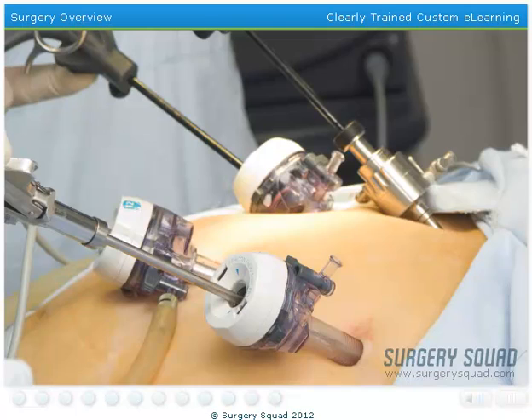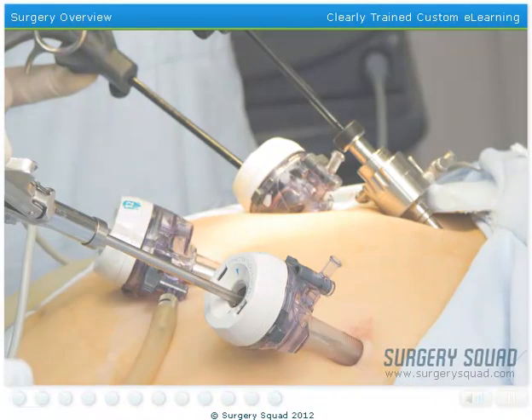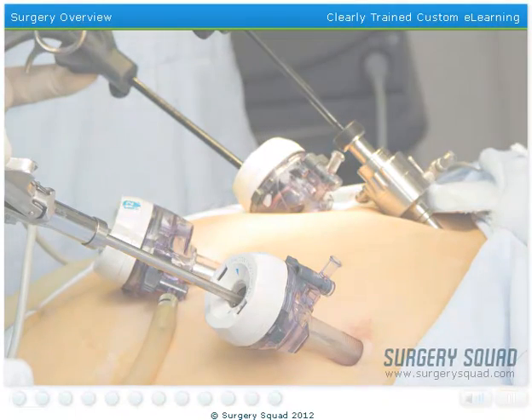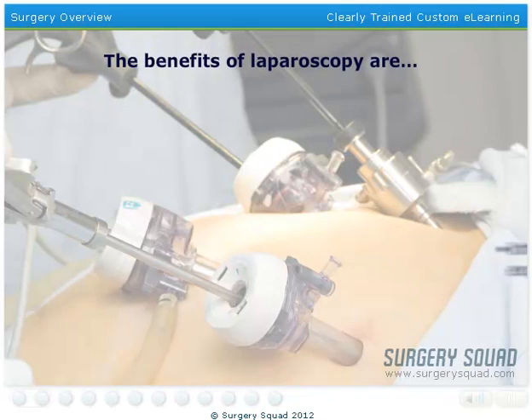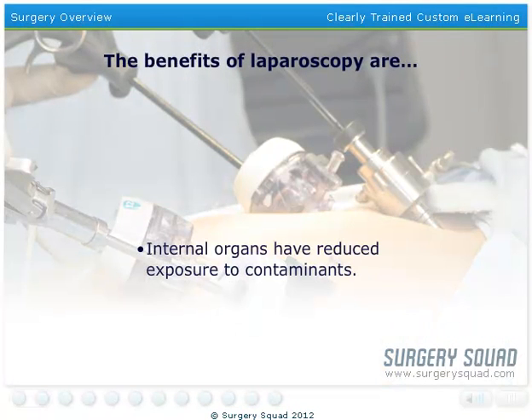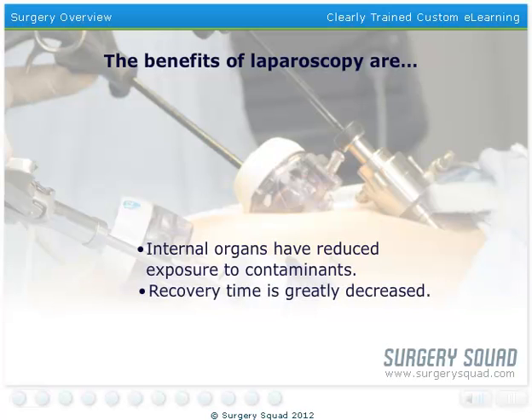Today, we'll be using a minimally invasive technique called laparoscopy to remove our patient's appendix. Laparoscopy reduces the exposure of internal organs to contaminants, shortens recovery time, and results in less post-operative scarring.